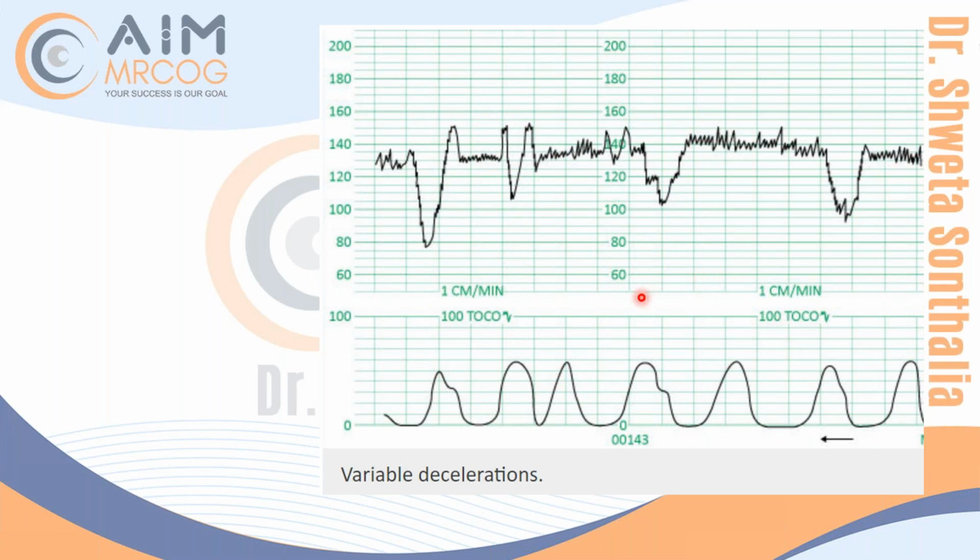But sometimes it is coming before the contraction and sometimes it is coming after the contraction. Like the initial one started before the contraction, and the last one is after the contraction. It started before the contraction and is recovering after the contraction. So that is one thing, that it is not looking exactly like the picture of a contraction.